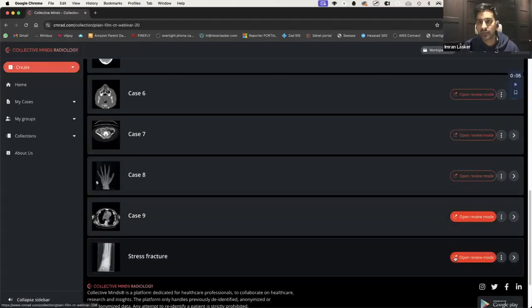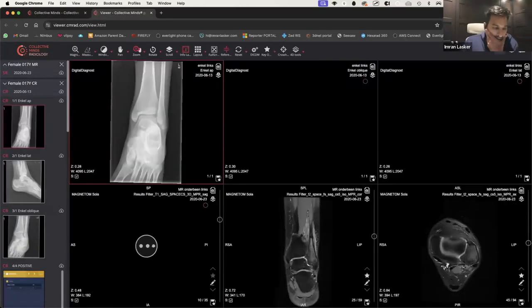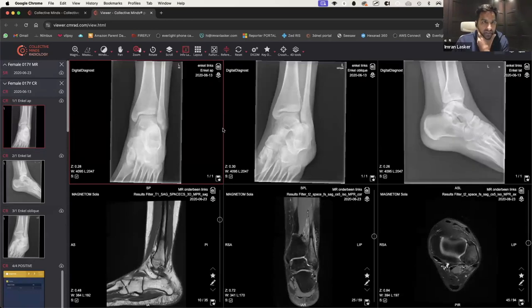So we are coming up to the last one, and let's share results. So actually, lymphadenopathy wouldn't really cause pleural plaques. You get calcifications of the lymph nodes. Lymph nodes would normally be in the mediastinum or the hilar regions, right? They normally follow the vessels, so you probably wouldn't get that. Consolidation, I guess so, if you get a parapneumonic pleural effusion secondary to consolidation, but generally speaking, it wouldn't. Rib fractures, like I said, which I spelt wrong, normally it's that rubbing sensation that can cause it.